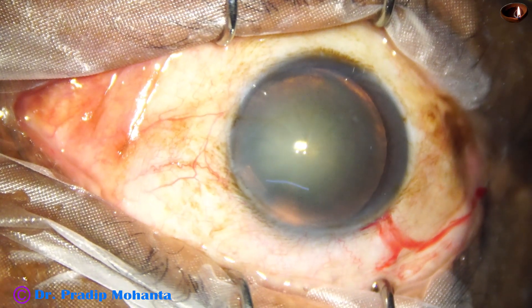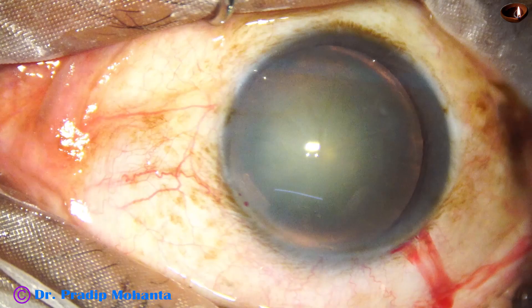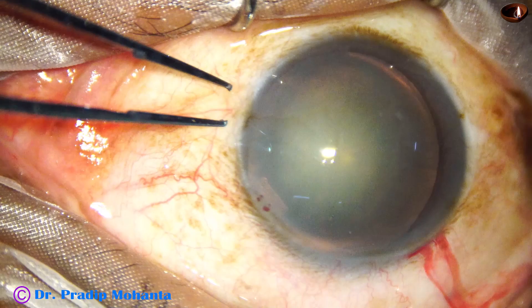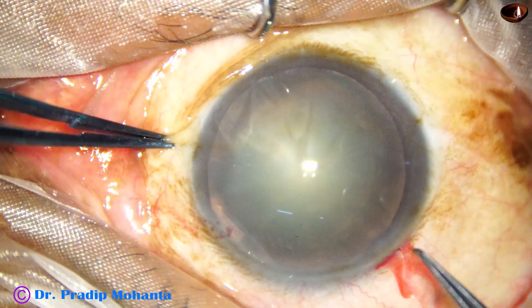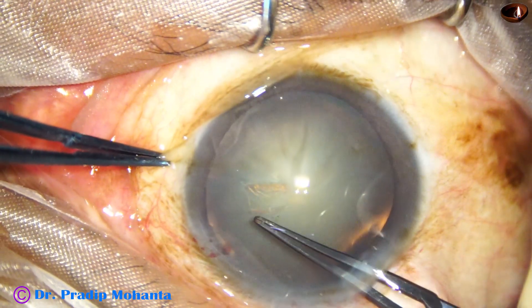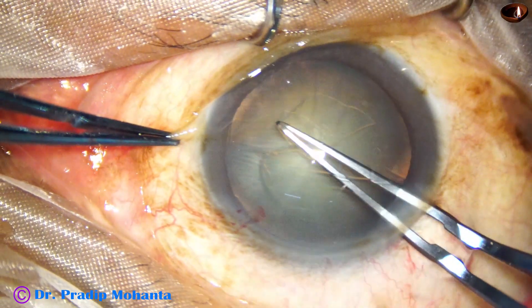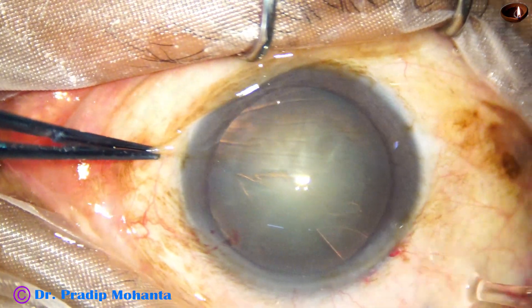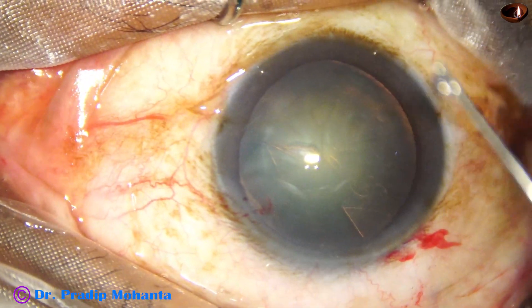And now, capsulorhexis. When the eyeball is tilted to any side, hold the eyeball with the forceps. Keep the eyeball in primary position looking straight upward and do the rhexis. You will do a nice round rhexis if the eyeball is in primary position looking straight towards the sky. So we have done a nice rhexis, almost like a femto-rhexis.